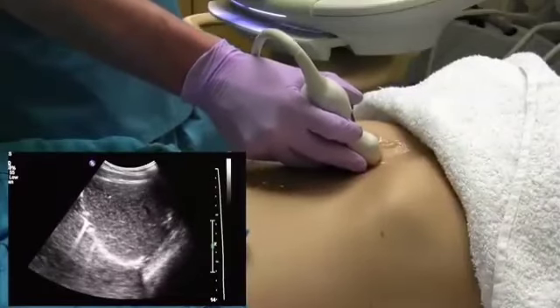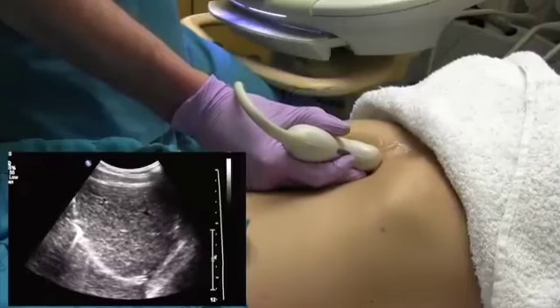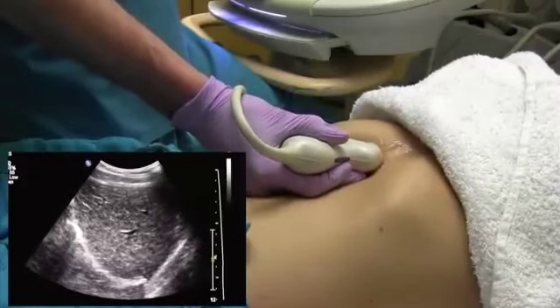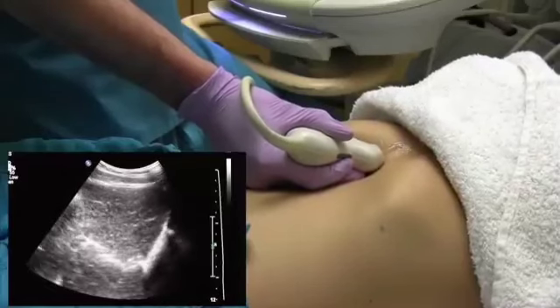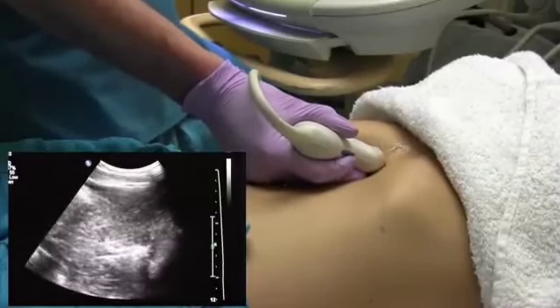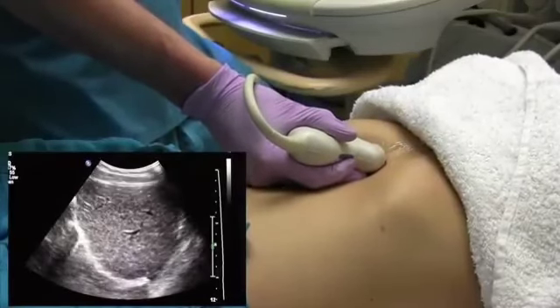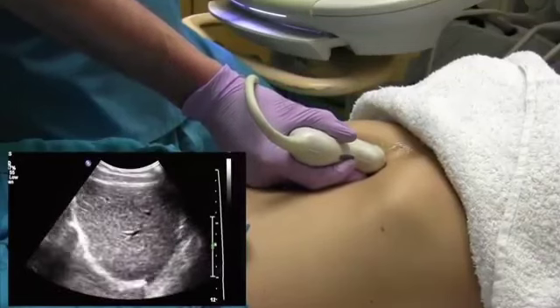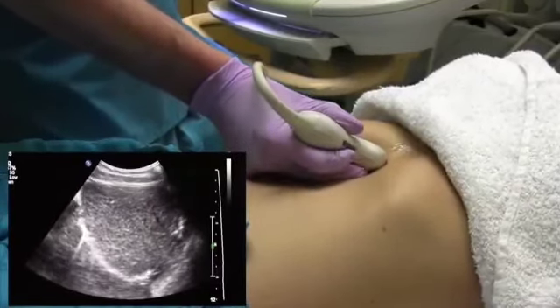leaked. And what you want to make sure you do is you're pushing in and angling up underneath this rib. And what I do is I start at the dome of the right lobe and then take sequential pictures as we come down. So the first picture I get of the right lobe is just the parenchyma. You're above all the hepatic veins and portal veins.